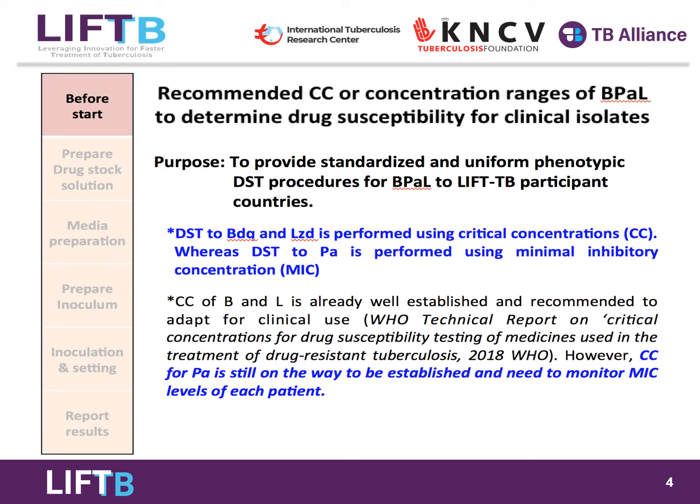As most of you already know from your experience with the bedaquiline and linezolid evaluations, WHO provides the critical concentration for determining resistance to bedaquiline and linezolid. You may refer to the WHO recommendations from the WHO Technical Report on critical concentrations for drug susceptibility testing of medicines used in the treatment of drug-resistant tuberculosis in 2018.